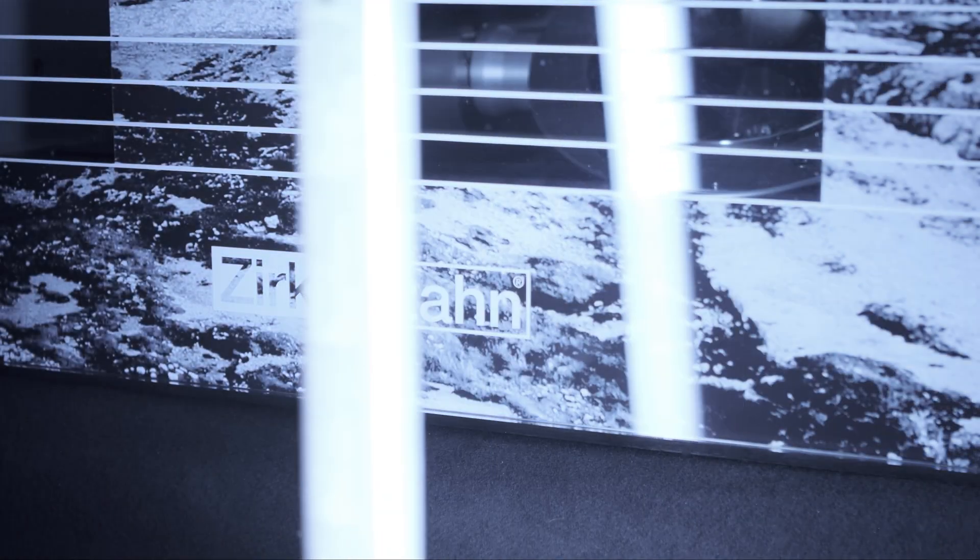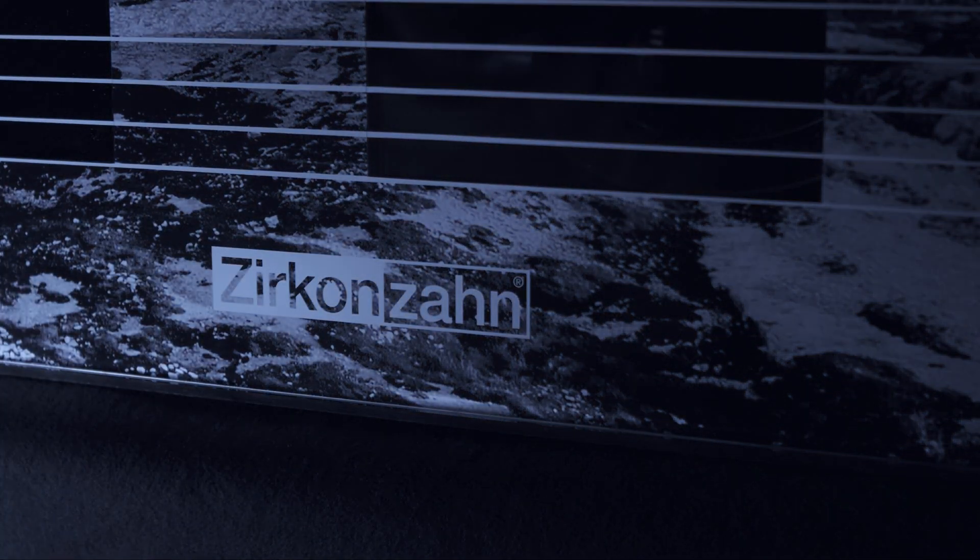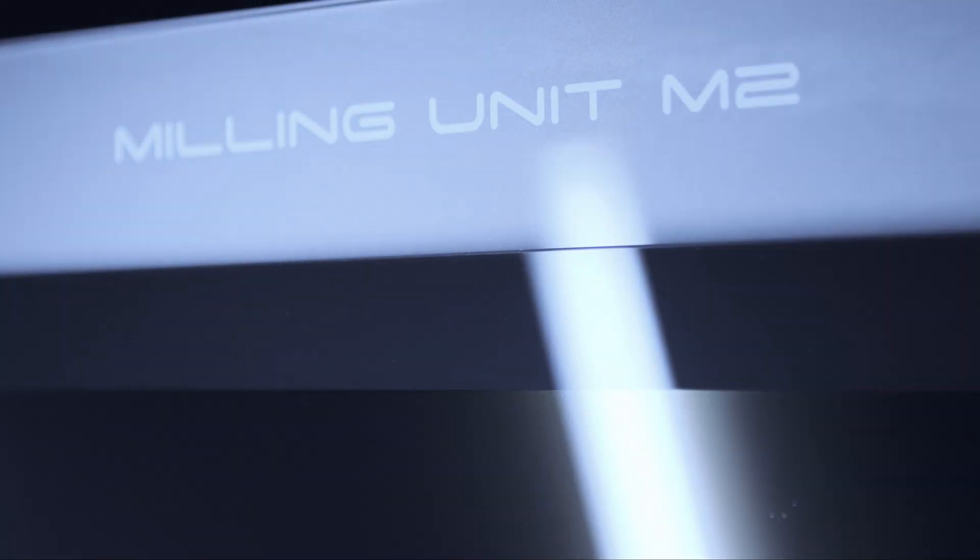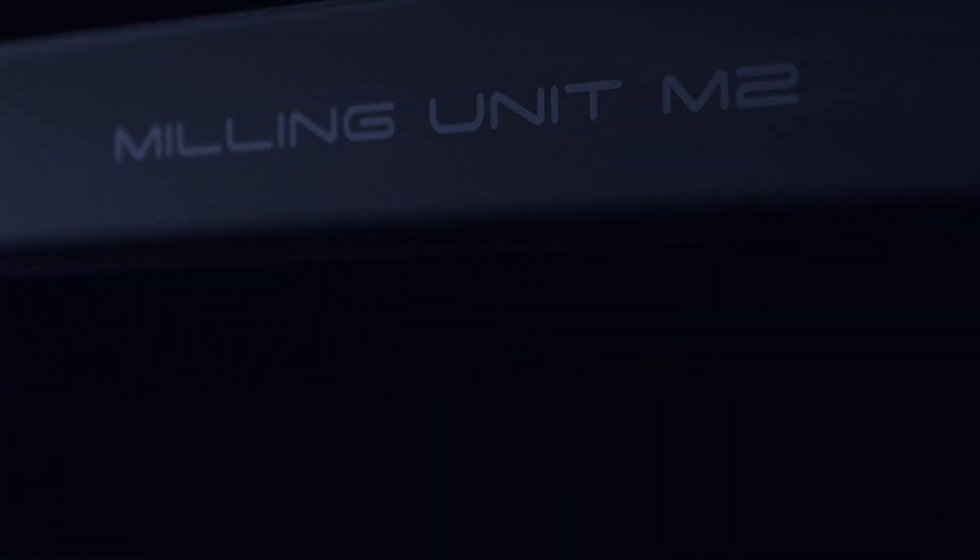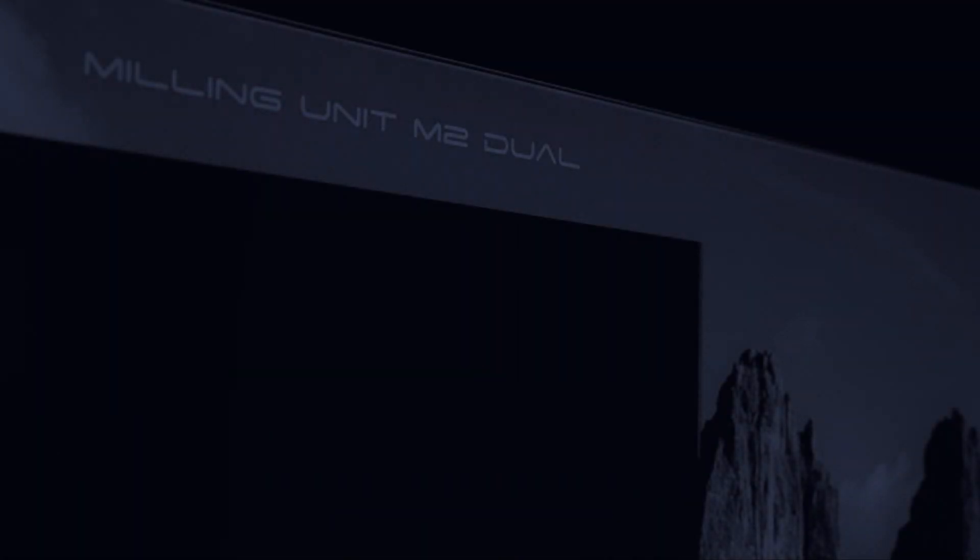With our new M2 milling unit Comfort Line, you can mill with maximum flexibility without impacts on the final milling result. In this video we will show you three ways to start and stop milling at any time during the process.